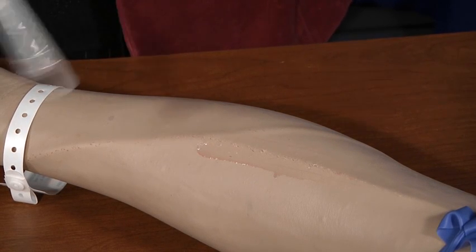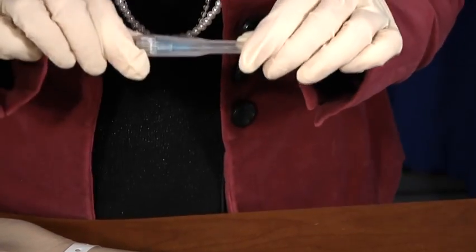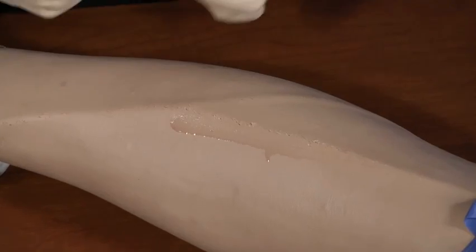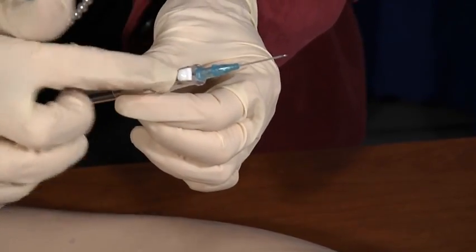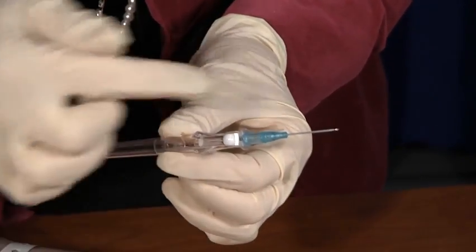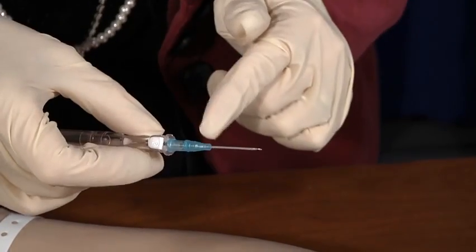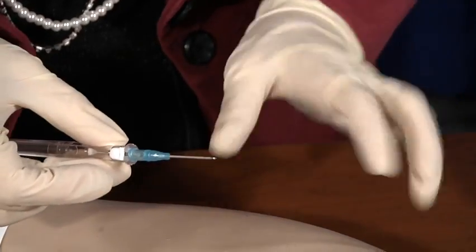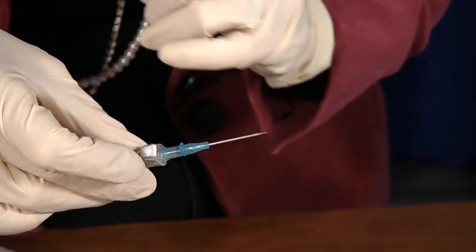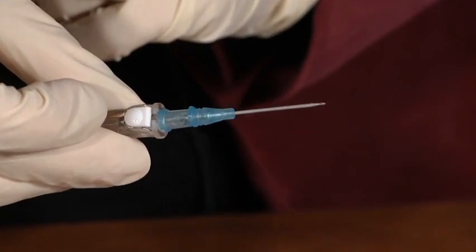And we have our catheter, that 22 gauge we were talking about, fairly small. This is what it looks like. You've got your chamber here, which is your flash chamber. It'll fill up with blood should we get into the vein. You've got this white button. Do not push the white button because that retracts the needle. It's for your protection, it's safety. We don't want to touch any of this part. That's sterile. That's what's going into the vein. And you'll see that you've got a needle and then you have this clear plastic catheter over the needle. So when you push this button, the needle goes in, catheter stays in place.